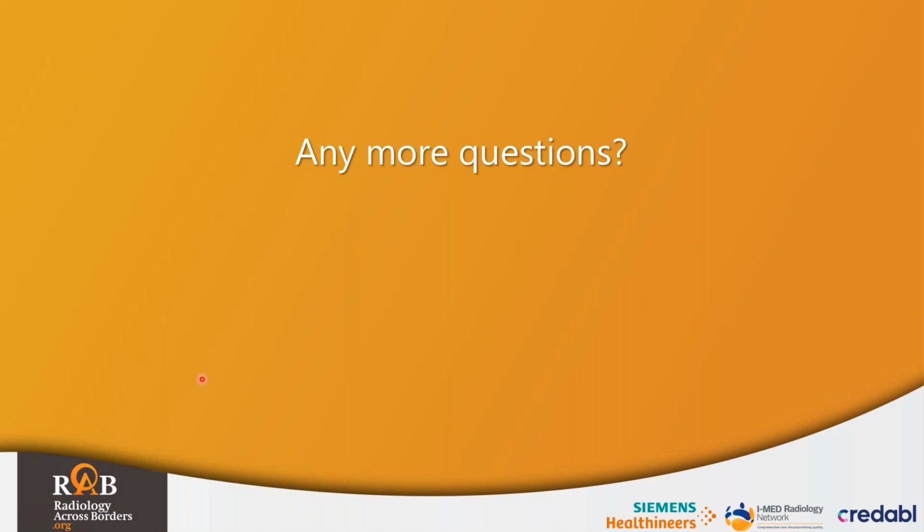Okay, we have another question from Sandra, and this one is, why do we pick 100 Hounsfield units? I think Sandra is saying that they tend to use 150 Hounsfield units in their practice. Yep. It depends how the system is doing it. I'm talking from a Siemens perspective here.